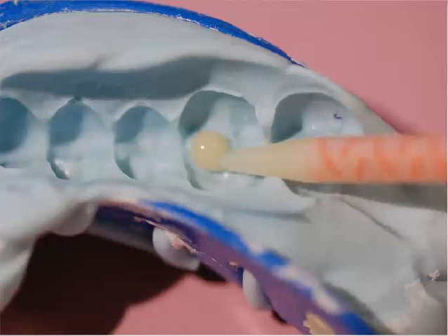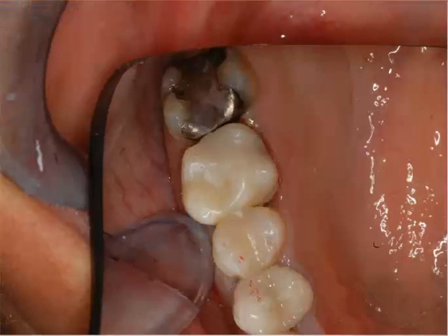It certainly aids us. We don't have to pour it up right away like polyether, and it allows us to go ahead and pour it up later. Maybe it's 4:30 at night, people want to get home, everybody's tired. Take your impression, it's stable for a long period of time. So in this case, we're using our bisacrylic resin material from our pre-op mold. We're going to go ahead and insert that in the mouth. After 4 minutes, you have this very well-fashioned provisional.